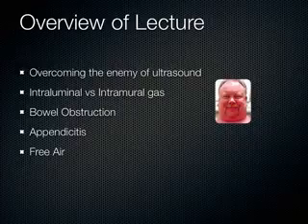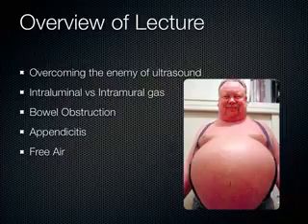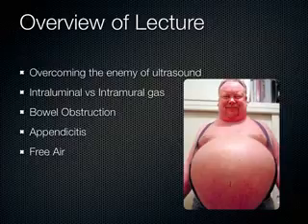And in some patients, it's pretty significant how much bowel gas they can have, right? So that's why we have to somehow overcome that enemy. Now, in a guy like this, I don't know if there's anything I could do to actually examine his bowel using ultrasound, because he's just so at the end of that spectrum of bowel distension. But in other patients, though, we can get through and see their intestines actually quite easily, even when they have a lot of pathology, which I'll show you here in a second.